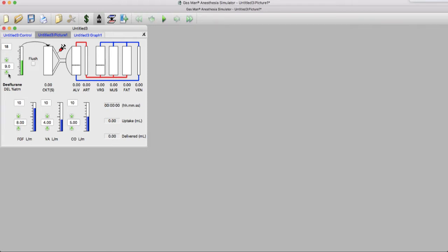We're going to look at an anesthetic with Desflurane. With Desflurane, we're going to start with an 8-liter fresh gas flow and the vaporizer set to 9%. This is something like what the package insert suggests in using Desflurane at a time after the airway is secured.